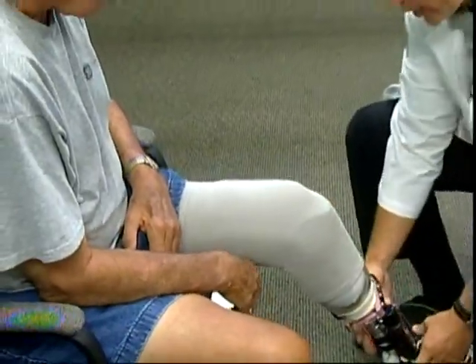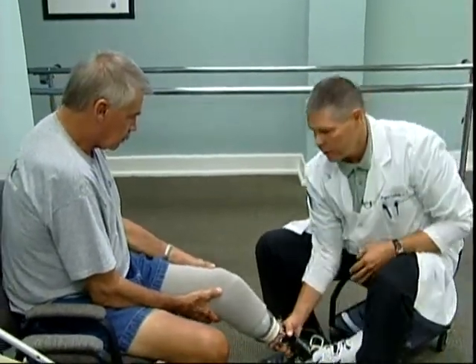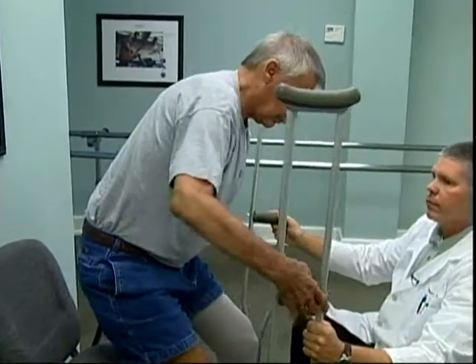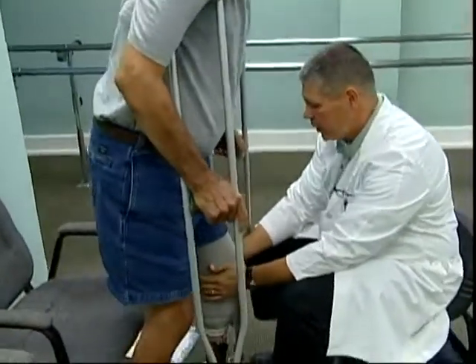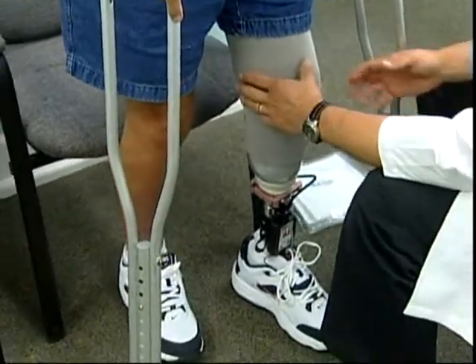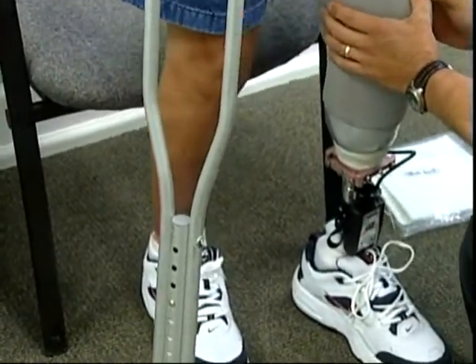Okay, so at this point, we've got the prosthesis suspended, but there's still some displacement going on. Okay? So I'm going to get your crutches here and ask you to stand up again. That's it. Got them underneath you there. Okay, so now we've got him down inside the prosthesis. We're going to turn the vacuum on. What do those numbers mean? That means that we are obtaining vacuum as he puts weight down into the socket. What are you feeling, Tony? Do you feel anything?